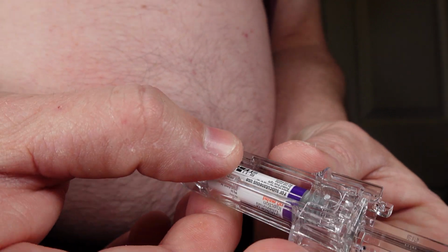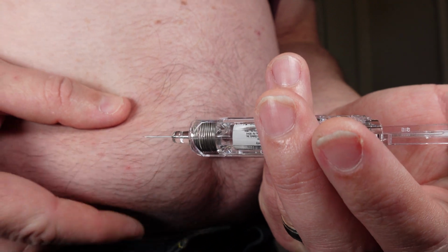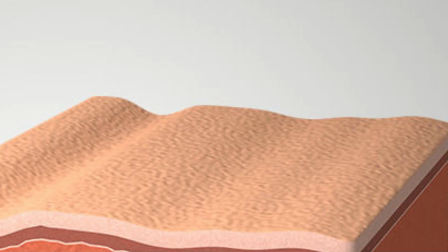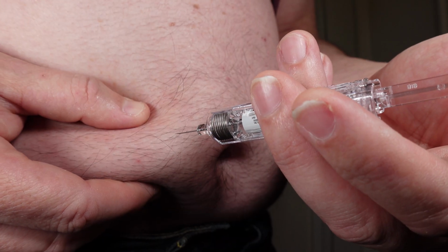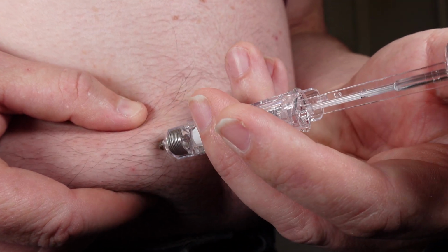So what you want to do is you want to pinch up a little bit of skin to hold it firm, and then take the needle in at a 45-degree angle. Now imagine your skin being a flat plane, and the angle in which the needle comes in should be approximately 45 degrees to that flat plane. Once you've done that, go ahead and stick the needle into the skin all the way in. You may feel a little bit of pinch at the very beginning. As soon as the needle goes in, I always feel a little bit of a sting. It's really not bad. Once the needle is in and penetrates the skin, then I don't feel anything.